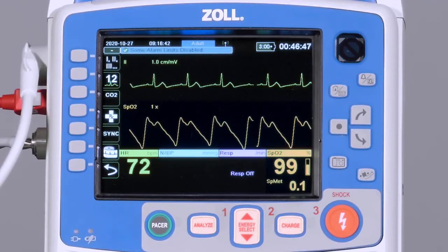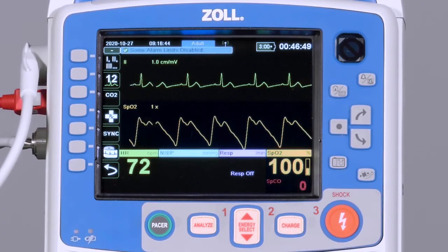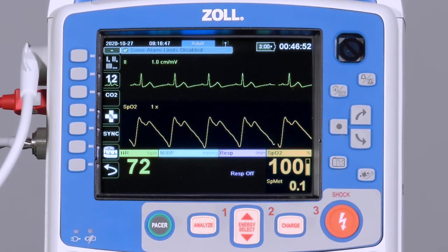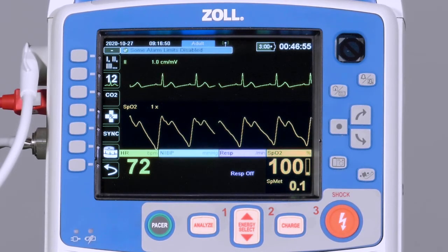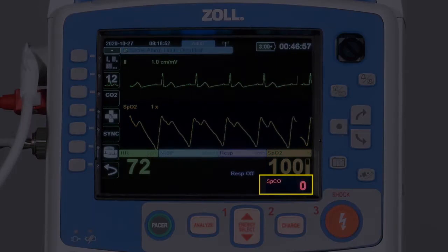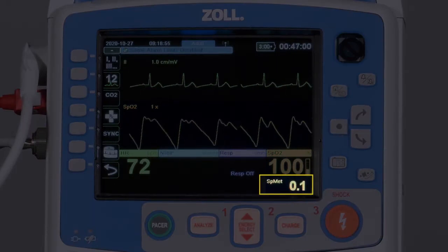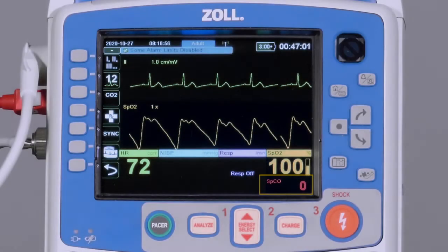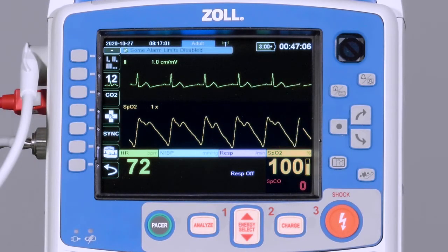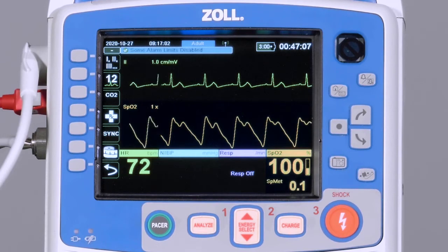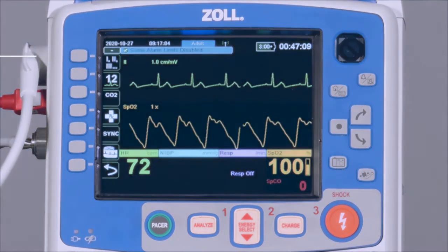If the X-Series Advanced is appropriately equipped and configured to display some or all of the Massimo Expanded Parameters, the measurements will alternate every two seconds underneath the pulse oximetry value. This allows all available parameters to be viewed by the provider without taking any extra steps to display them.